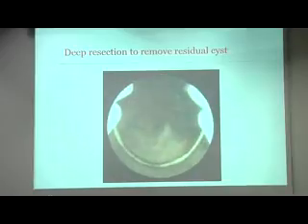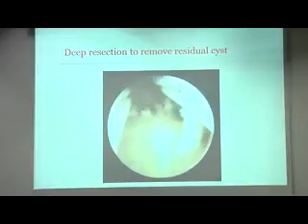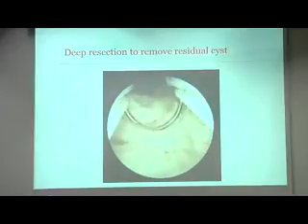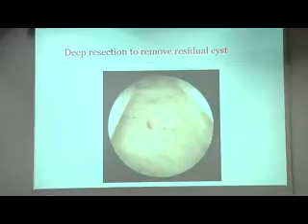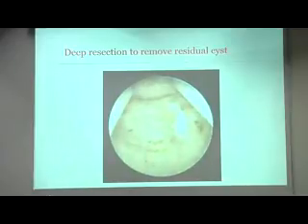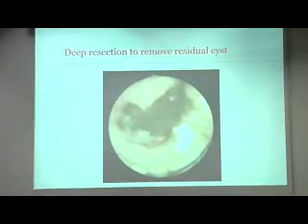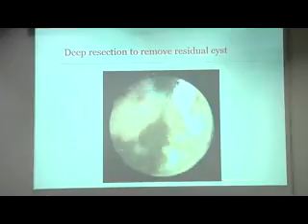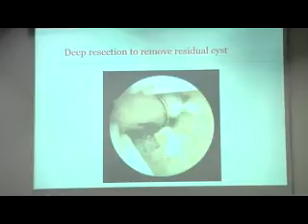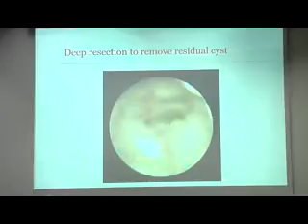This is okay, and now here we have to find it. You see the surgeon, which is me, but here you see it, the bulging. So we decide to cut here, and we decide to cut further, and we got it. Here, this is blood in a cyst, and if you don't have this, you've done nothing. You have to remove it.